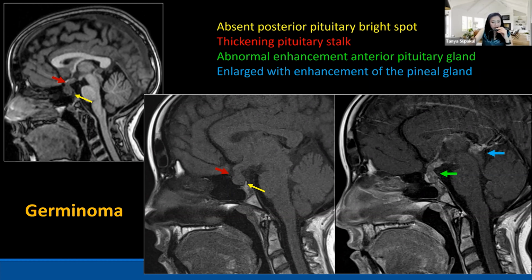And when you go down to the testicle, it's also a midline structure. For a testicular tumor, it's still germinoma. So germinoma to me is a midline tumor that can happen in the pituitary stalk, sella, and pineal regions. So almost always check these two locations. If you see something abnormal in the pineal, check the sella. If you see something abnormal in the sella, check the pineal.